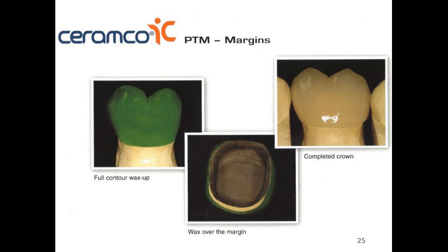For porcelain fused to metal, we can cover the margins with porcelain. This type of restoration shows a shoulder or chamfer margin. Looking at the finished crown, we can see there is metal underneath — this is a good way to mask the metal. The reason we use metal and then porcelain on top is that metal is a stronger material and lasts longer in the patient's mouth.